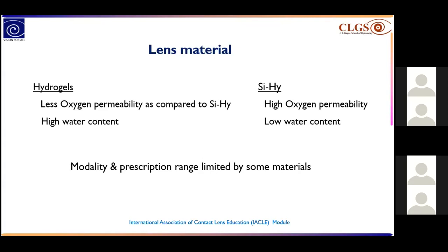And the meaning of high or low water content is that the lenses which have high water content will absorb more water from the eye, and the lenses which have low water content will absorb less water from the eye.